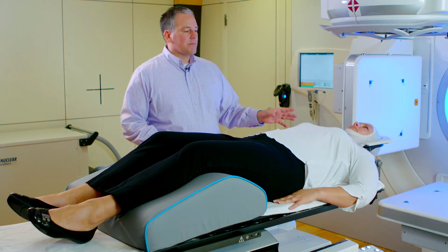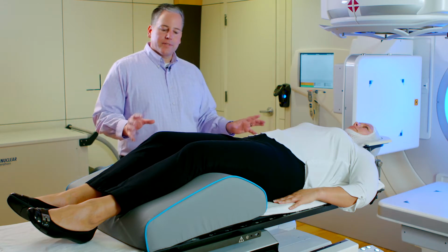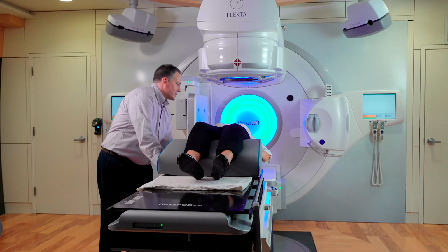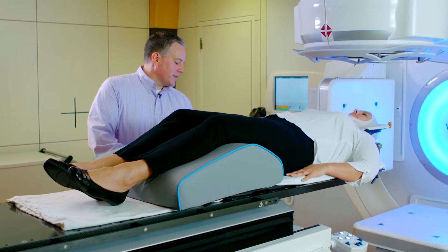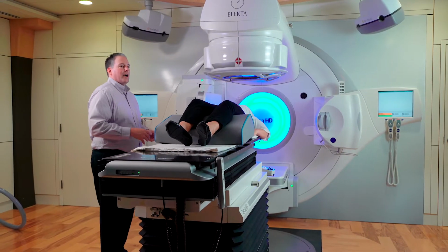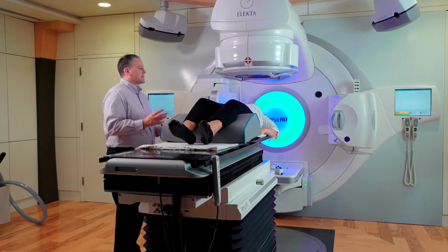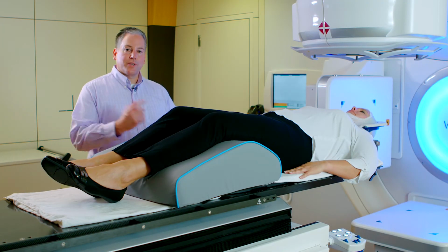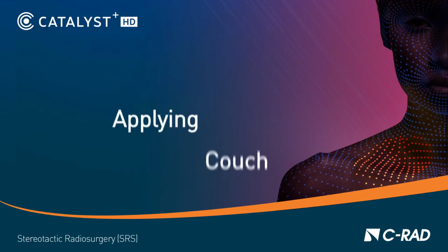You may also notice on the mask there's no marks. What we're going to do is we'll get the patient on the table, get them comfortable, and then we're going to just raise the table up and move the table into approximate isocenter. Once we get to roughly isocenter, we're going to let the Catalyst look at the patient, calculate where that isocenter is, and what shifts will need to be made to put the patient precisely in position. So at this point, we'll go to the Catalyst system and we'll send those shifts automatically to the table, which will drive that table into position.